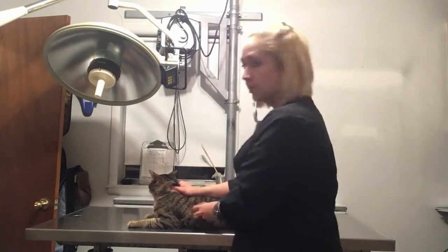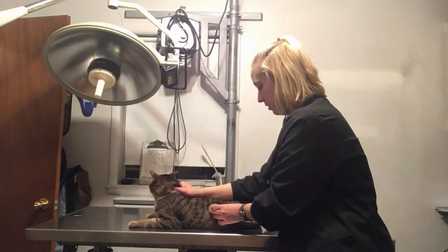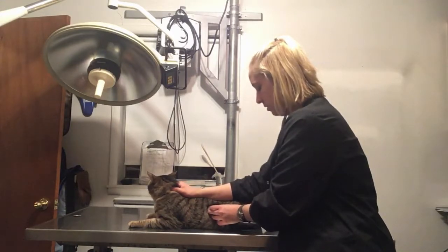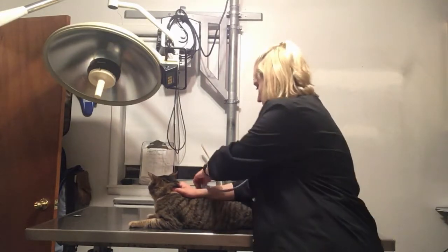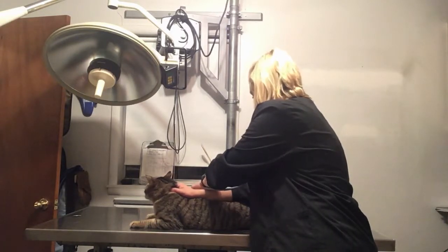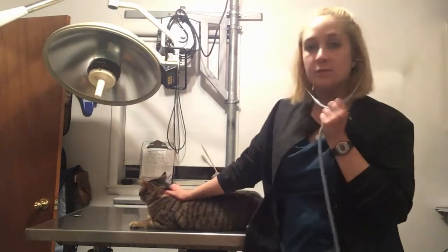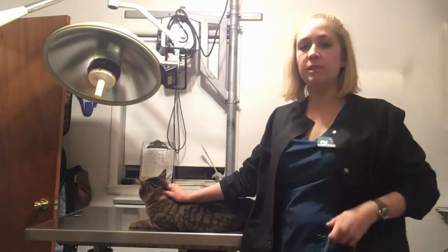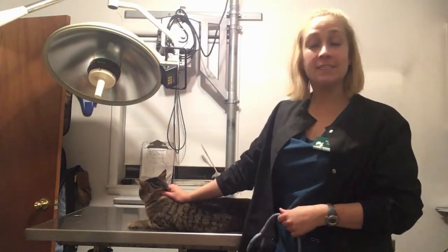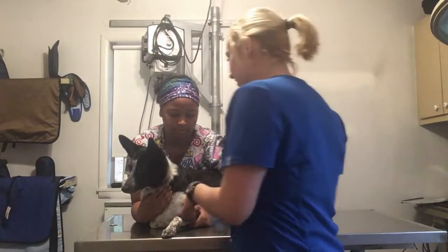Alright, her heart sounds good, no signs of a murmur. Alright, and breath sounds great as well. So I'm going to go ahead and give Miss Ruby here an ASA of 1. So this is going to be the cephalic vein on a canine.